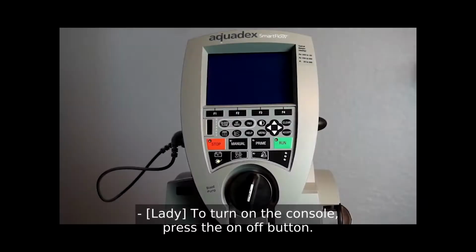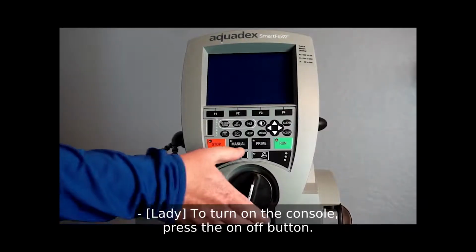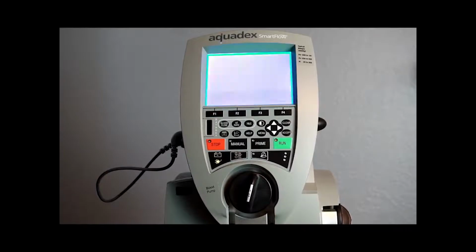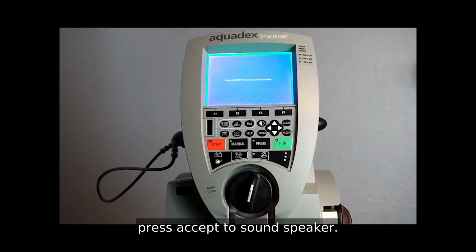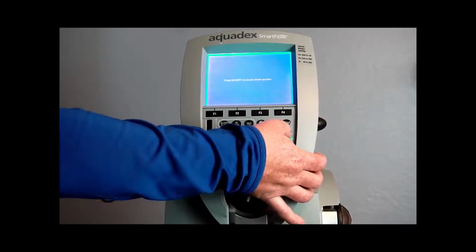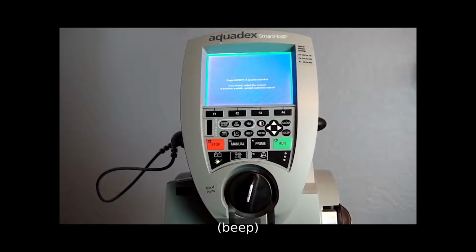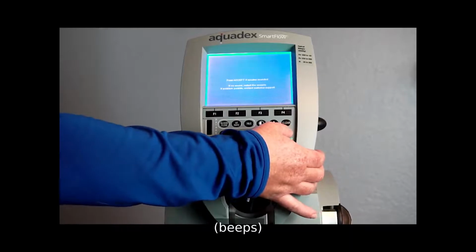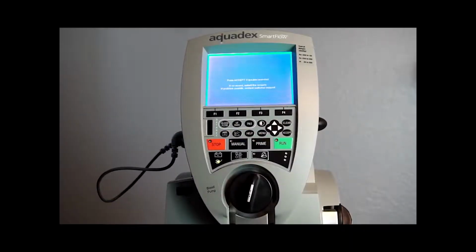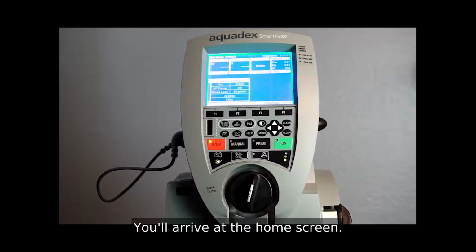To turn on the console, press the on-off button. Follow the screen prompts. Press accept to sound speaker. Press accept if speaker sound is heard. You arrive at the home screen.